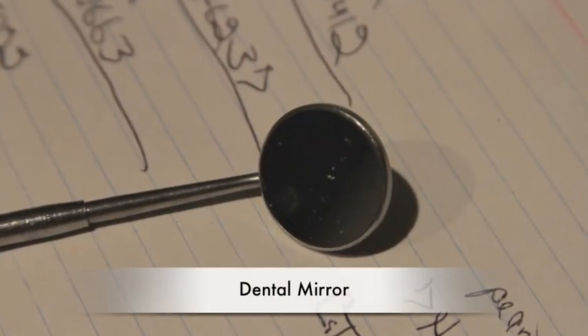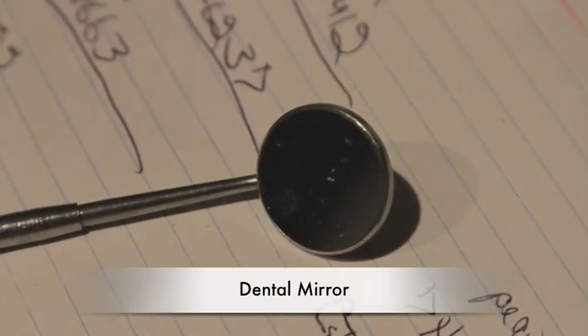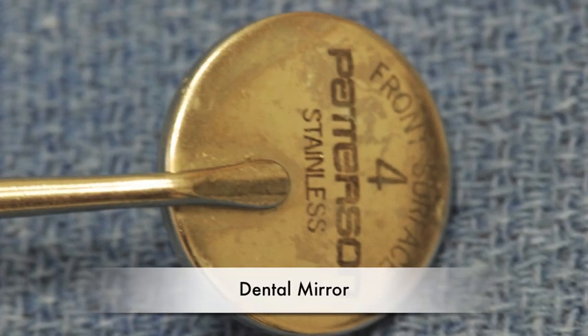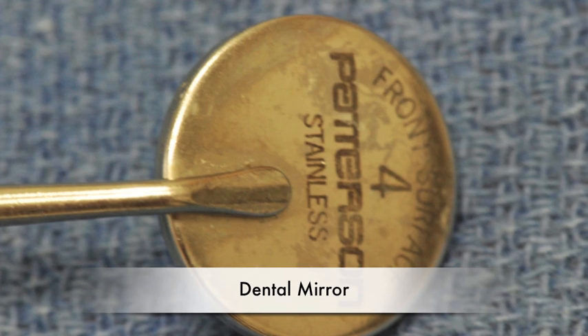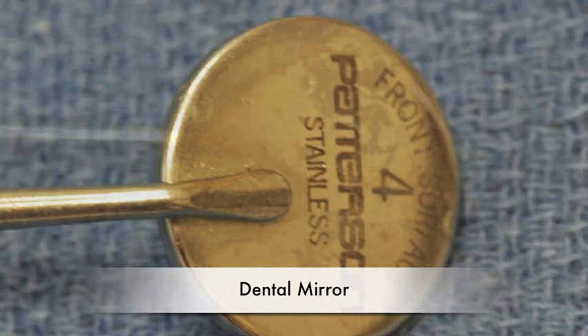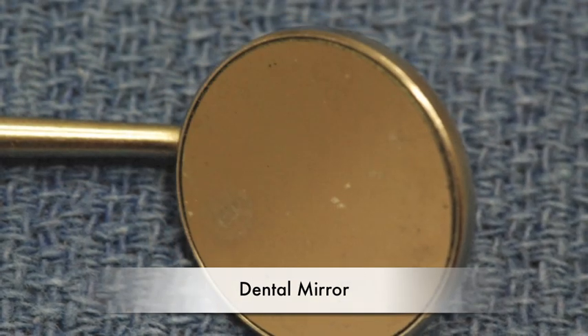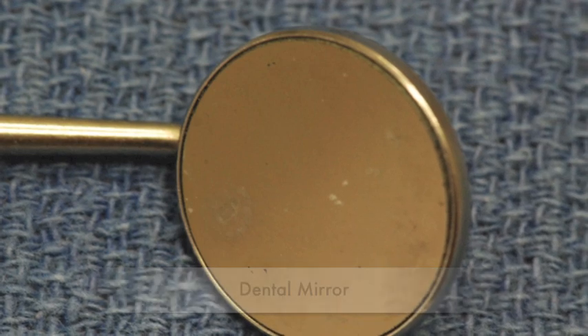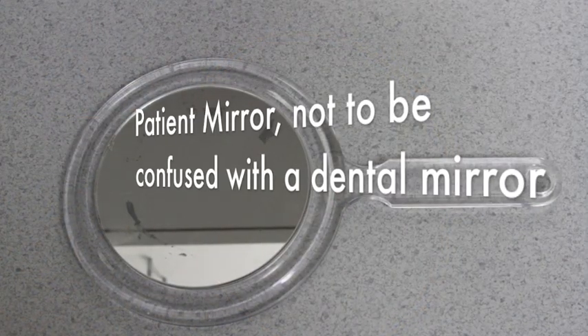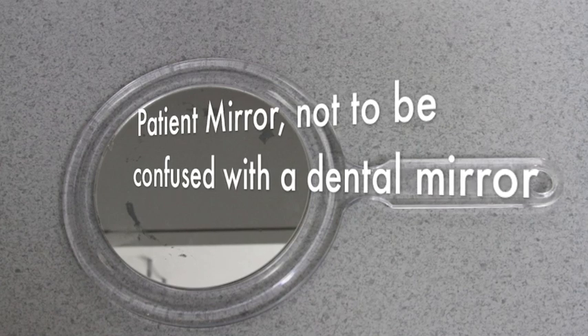The instrument shown here is the dental mirror. The dental mirror is principally used for examination, to visualize, but it's also used to reflect, to move tissues so the doctor can see better. As you pass this instrument, always be sure to pass it so that the mirror face is clean. That way, the doctor can most efficiently use the instrument during the course of care.